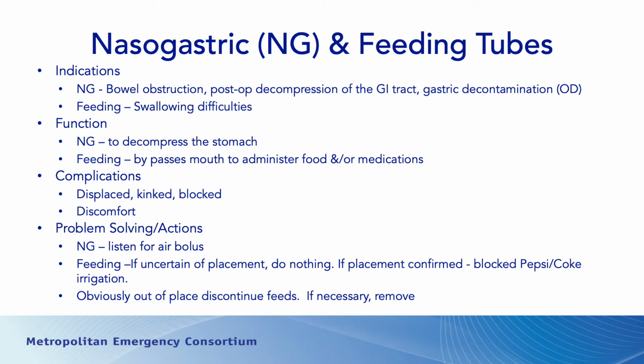It's stiffer. It's more likely to cause discomfort. The feeding tubes are more likely to become kinked or blocked, particularly if they're not well managed and irrigated after use. So if you're giving a medication or nutrition through the feeding tube and you don't irrigate the tube after the feed or after the medication, it can get blocked. Sometimes the tubes can get kinked, and often the tubes can be displaced. The patient can become agitated and pull it out.